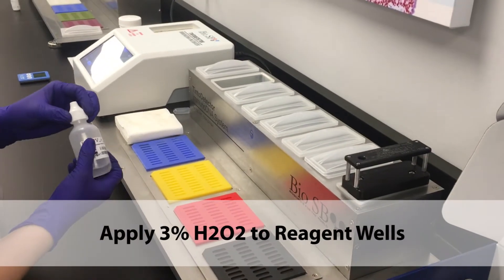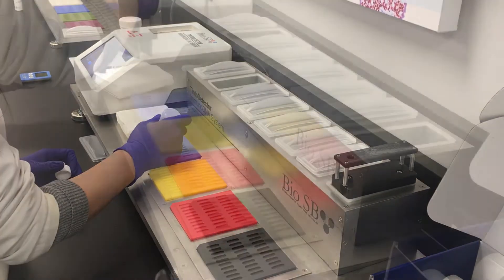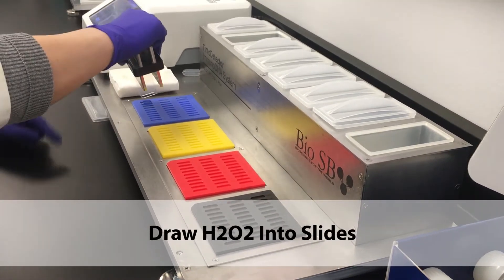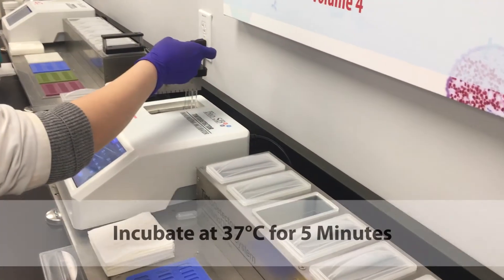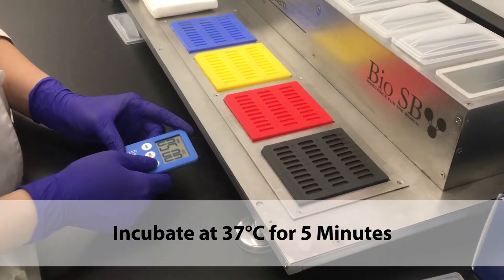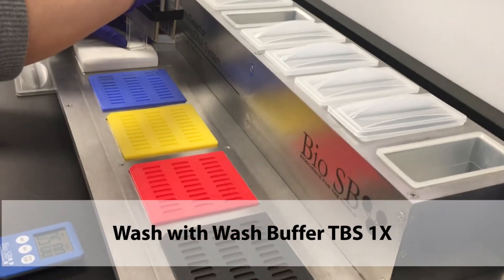Incubate at 80 degrees Celsius for 5 minutes. Apply 3% H2O2 to reagent wells. Draw H2O2 into the slides and incubate at 37 degrees Celsius for 5 minutes. Wash with wash buffer.